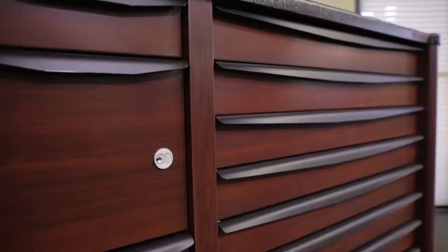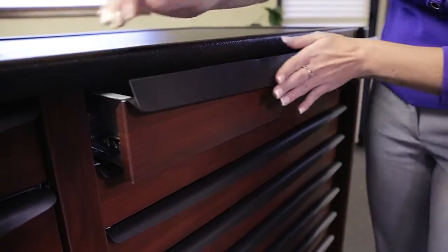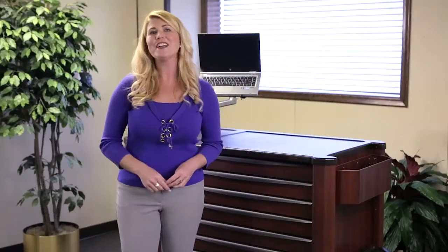Drawer handle covers now come standard with every cart and can be replaced as necessary. These covers will protect against and cover any existing nicks and scratches on drawer handles. They simply cling to the handle and can be removed and replaced at any time. Rx Care Assurance carts require little maintenance and deliver high quality performance unmatched in the industry.